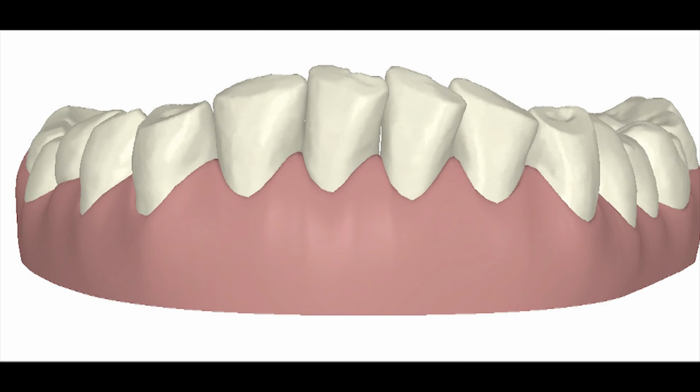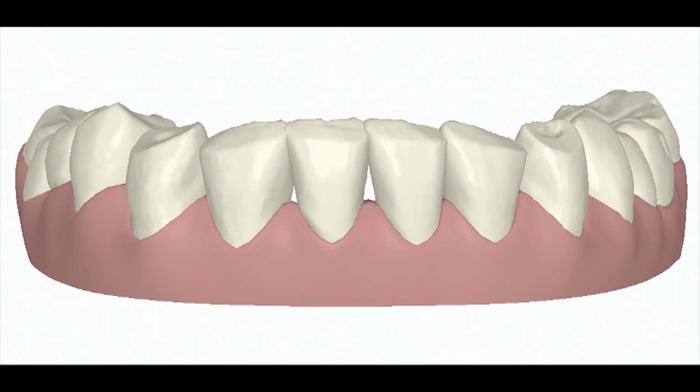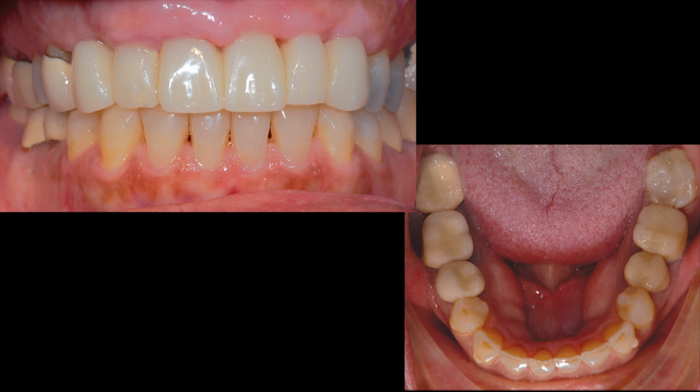Orthodontic treatment produced the desired results: tooth movements. The ClinCheck predictions for anterior intrusion estimated a reduction of the anterior vertical appearance of deep bite from 75% to a more reasonable 25%. The post-treatment intraoral images illustrate clinical results that mirror the virtual plan, including successful intrusion of the mandibular incisors. The desired rotation of the anterior dentition needed to resolve the crowding issue and correct the occlusion was also achieved.